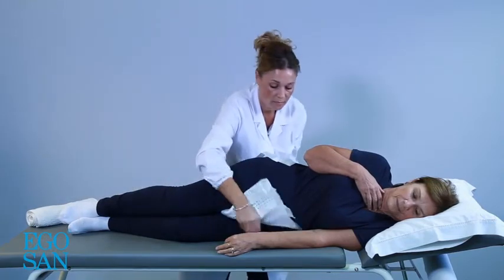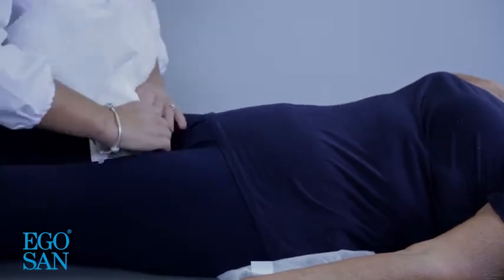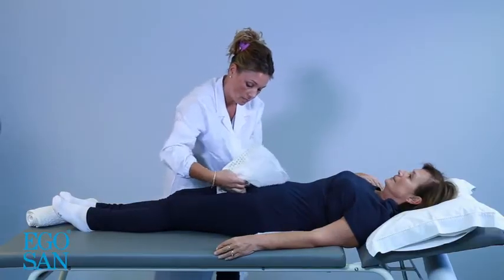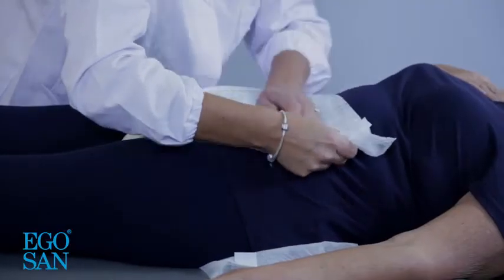Take the far ends of the product and cover the bottom properly. The blue marking on the outer side is the wetness indicator, and at this point it should be parallel to the perineum. When the pad is soaked, the marking fades away.